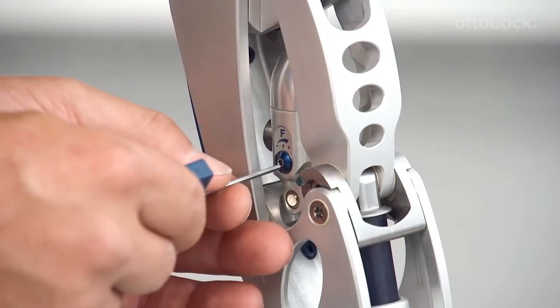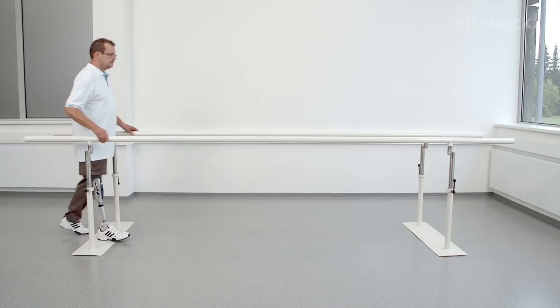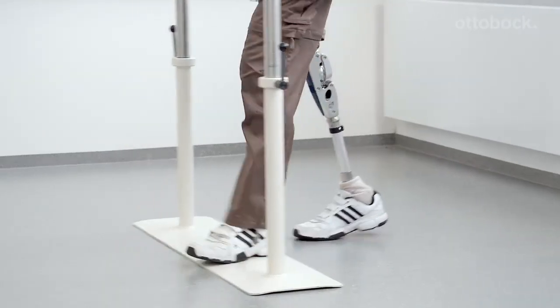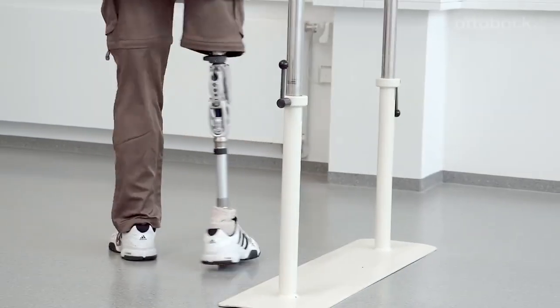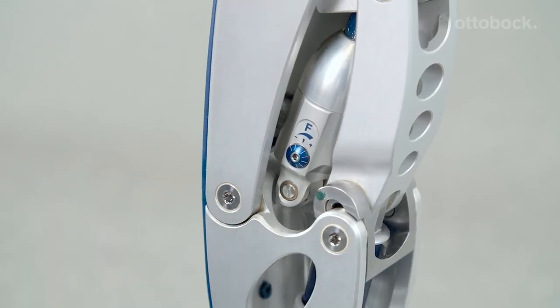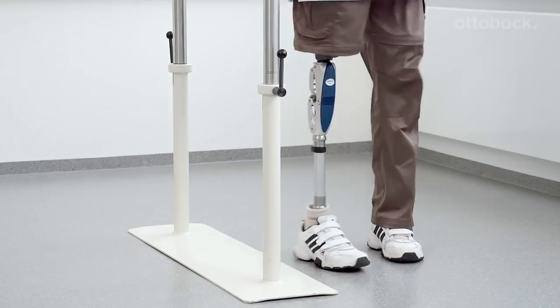At this point, the flexion damping is shown at the maximum. As shown in this sequence, the knee flexion is too little for the user. The shank swings forward too quickly, which results in a hard extension stop and little ground clearance in the middle of the swing phase. This results in an increased risk of tripping. Please reduce the flexion damping in small increments so that the knee flexion is equal on both sides and the gait pattern becomes harmonious.